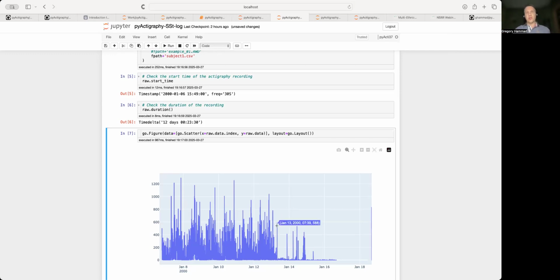Here it's slightly different. It sometimes depends on the protocol, but you might instruct participants to wear the device for, I don't know, so many days, and the recording is still maybe set up to run a little bit more, like 10 days. Depending on the device, sometimes you can say, look, I will start after the configuration, and delay the start by so many hours, but sometimes you just configure it and it starts to acquire data right now.